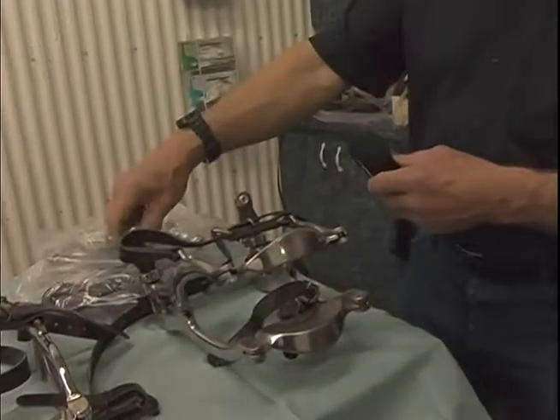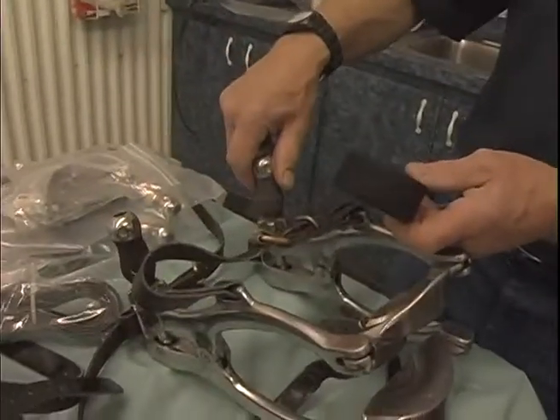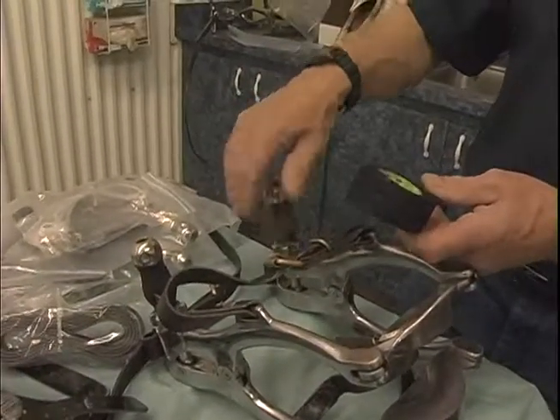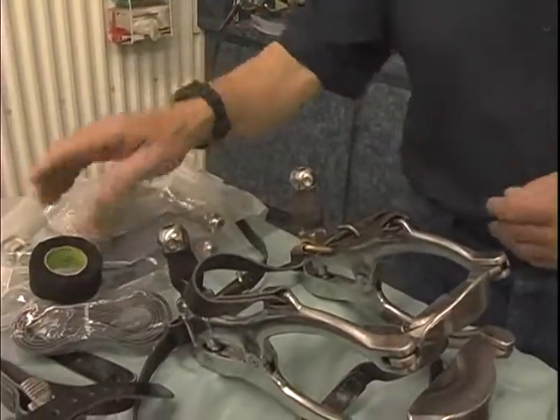In order to add some friction to the turning handles, we use some ice hockey tape and just wrap it around the handles. The handles are stainless steel and could be slightly slippery for some people without the use of this tape to add friction.